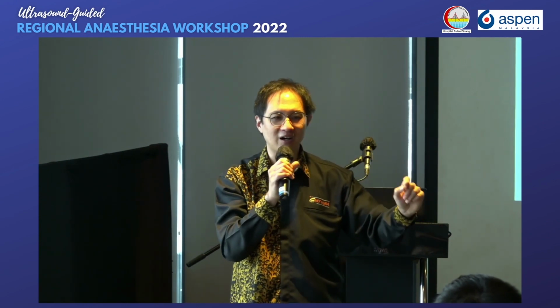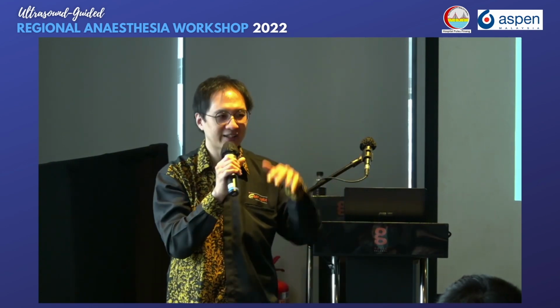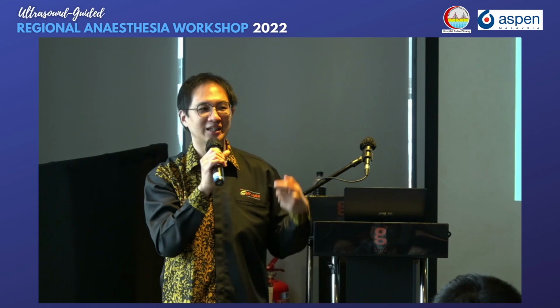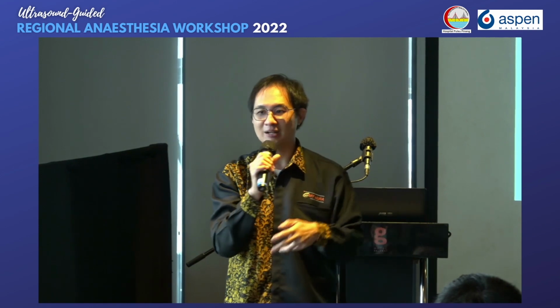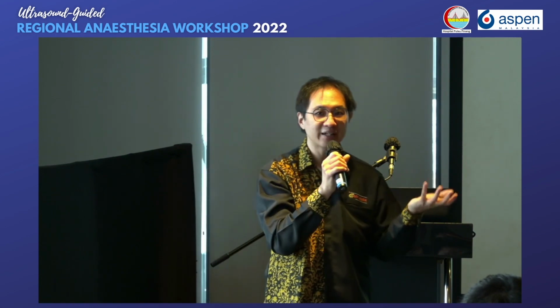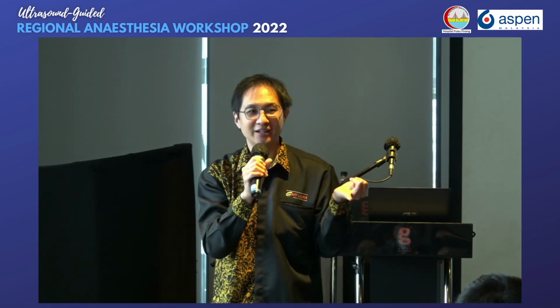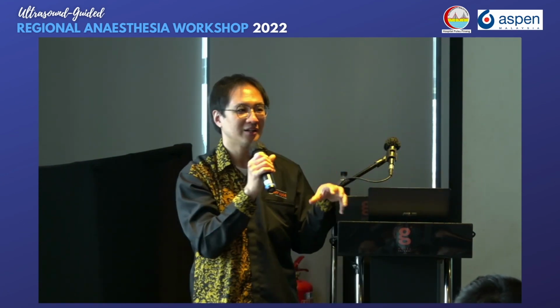You don't puncture the nerve. You don't put the needle on the nerve or next to the nerve. No, you put it in a muscle myofascial plane, and hopefully by giving a large amount of LA, the LA will go and block the nerve at another site. So yes, if your surgery is done under spinal, it is recommended that you give a fascia iliaca block post-op to provide better multimodal analgesia. Like I said, our trend now is going towards procedure-specific, multimodal, opioid-sparing analgesia, and to promote early mobilization of patients. So then there is a role for blocks.